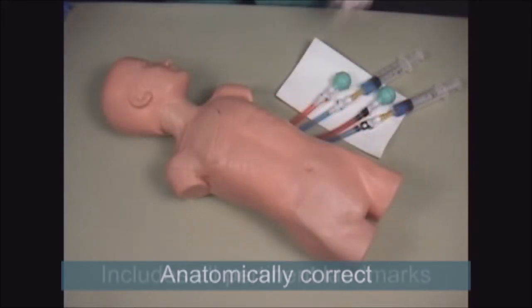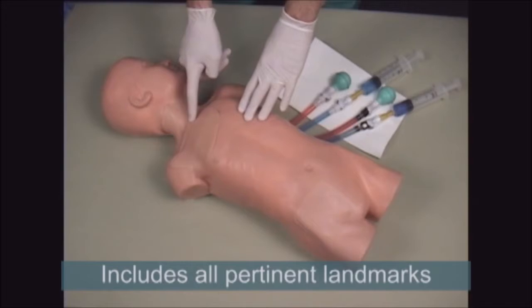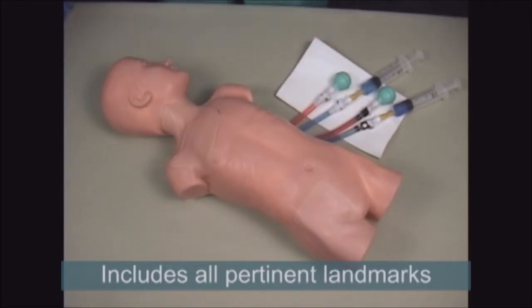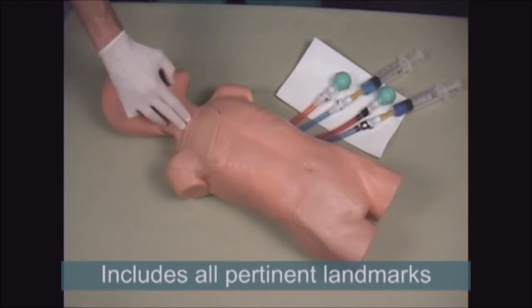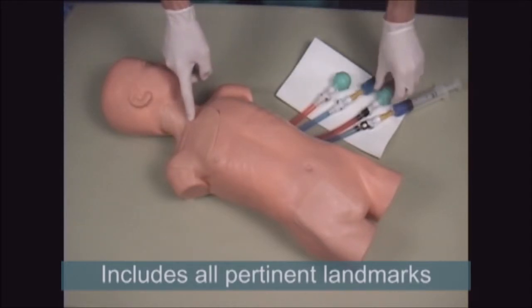The subclavian site includes the sternal notch, the first rib, and the clavicle. For the internal jugular site, the user will be able to locate the apex of the triangle formed by the 2 heads of the sternocleidomastoid, the clavicle, and the pulse of the carotid artery.